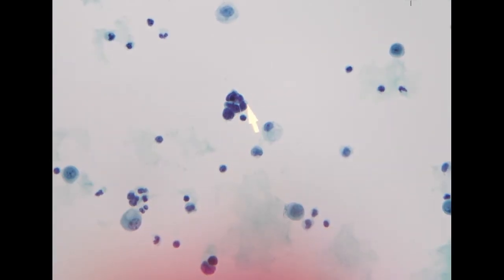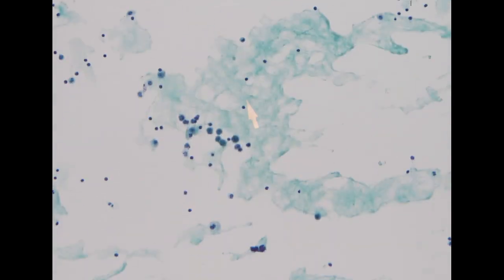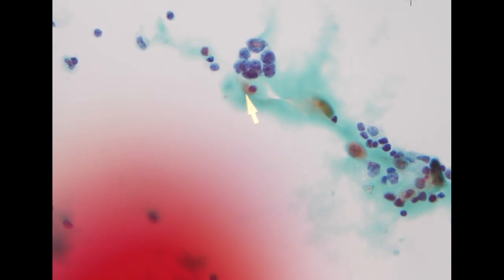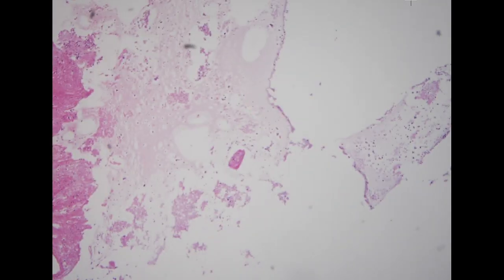Sometimes you will also see a cell-in-cell pattern. So when you see these very dark, very tight, smaller clusters of cells, you need to think about small cell carcinoma. So I think this is a classic case of small cell carcinoma involving the pleural effusion. The patient has already been confirmed of the diagnosis, so it is not difficult for us because the clinician already put it in the requisition sheet.